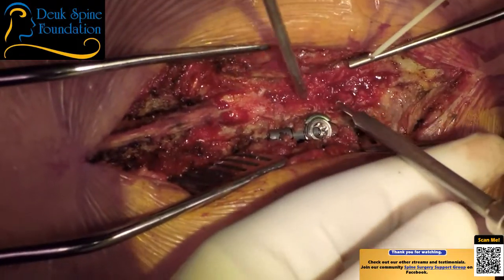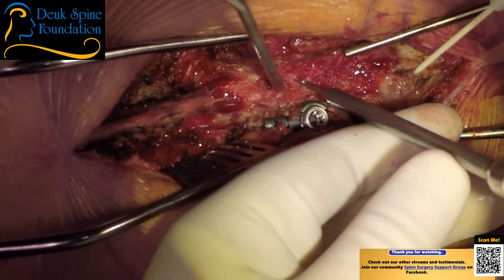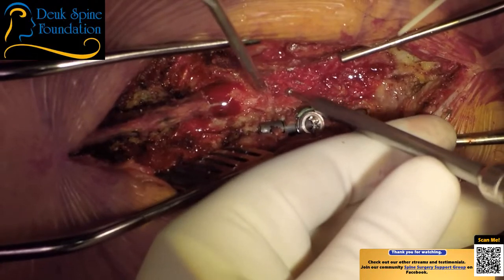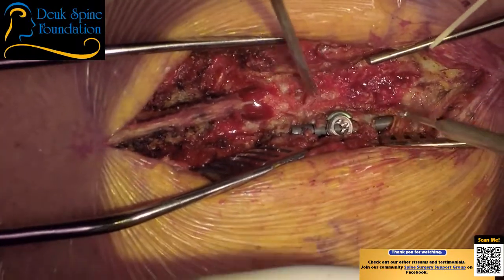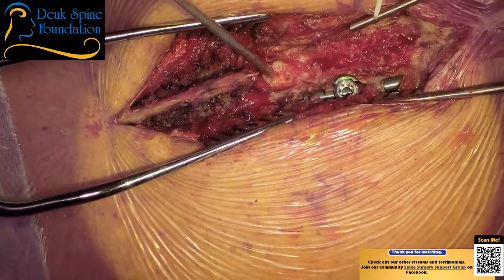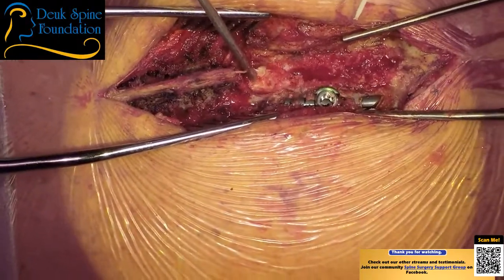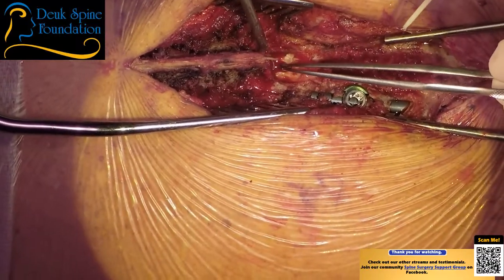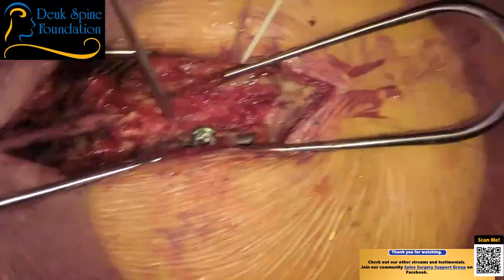I need you to suck here so I can see what I've got. Yeah. That makes sense. Please don't ruin the sucker if you can. Try to figure out my pattern of movement. I'm drilling a trough. Suck here. Let's see, gel foam, throw on it. A bipolar, just give me a bipolar. There's a little vein on the outside that I'm gonna see if I can bipolar. Pain in the butt. So here, more volume. Get it? There, see? That worked.